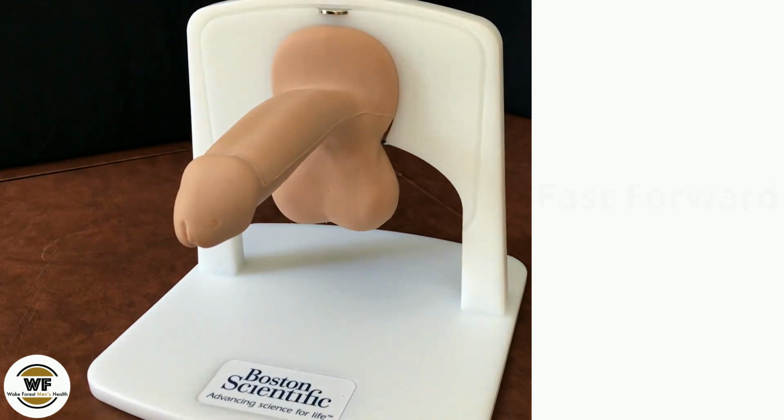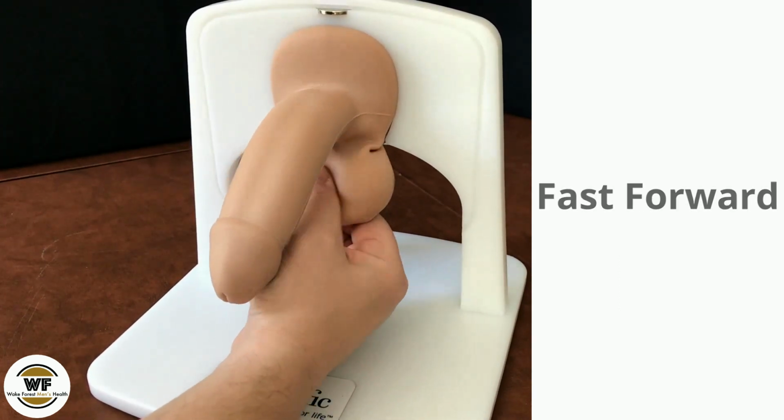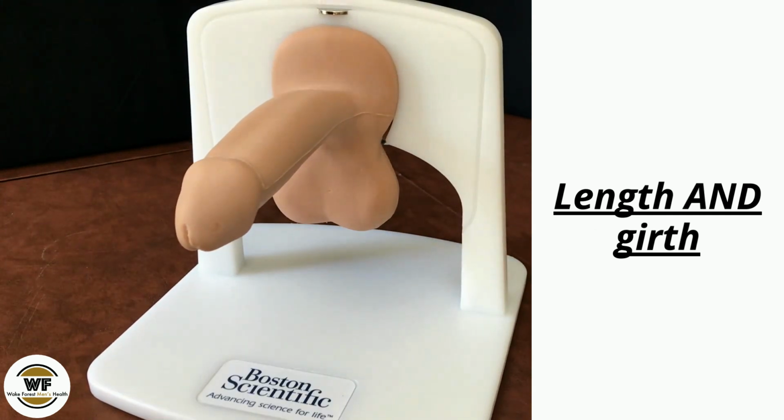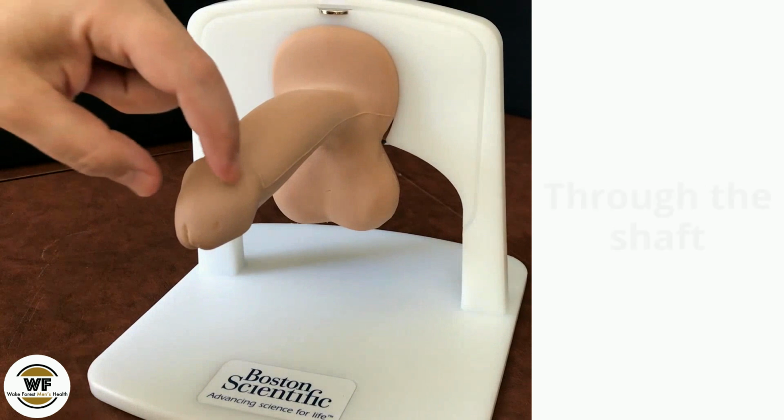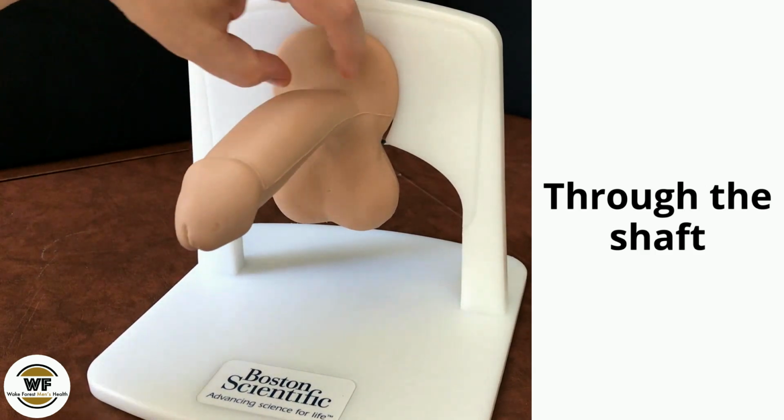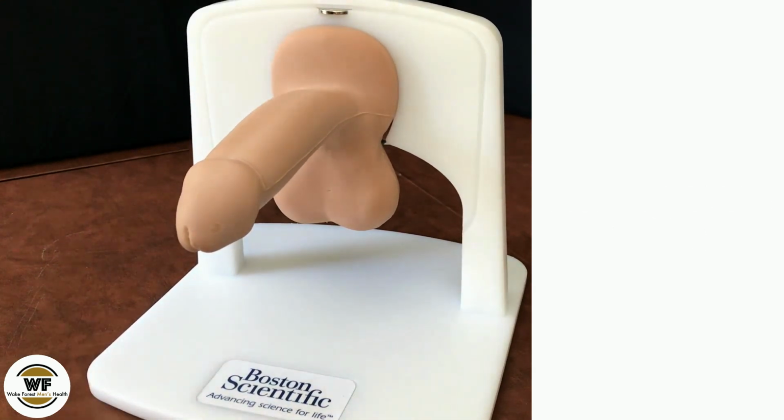Let's watch again and fast forward. Watch how the model expands in length and girth. The tips of the cylinders rest behind the head of the penis and run through the shaft all the way to the back of the natural erectile tissue chambers.